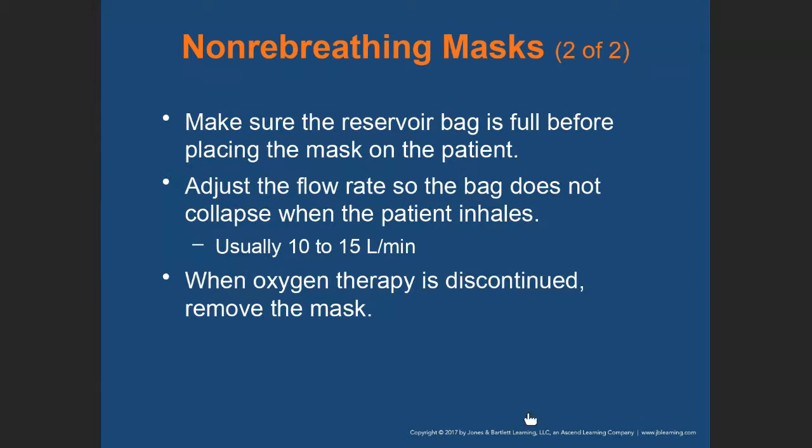Make sure the reservoir bag is full before placing the mask on the patient. Adjust the flow rate so the bag does not collapse when the patient inhales. So with a non-rebreather, you're looking at 10 to 15 liters, and we tend to start on the lower end and gradually go up if necessary.